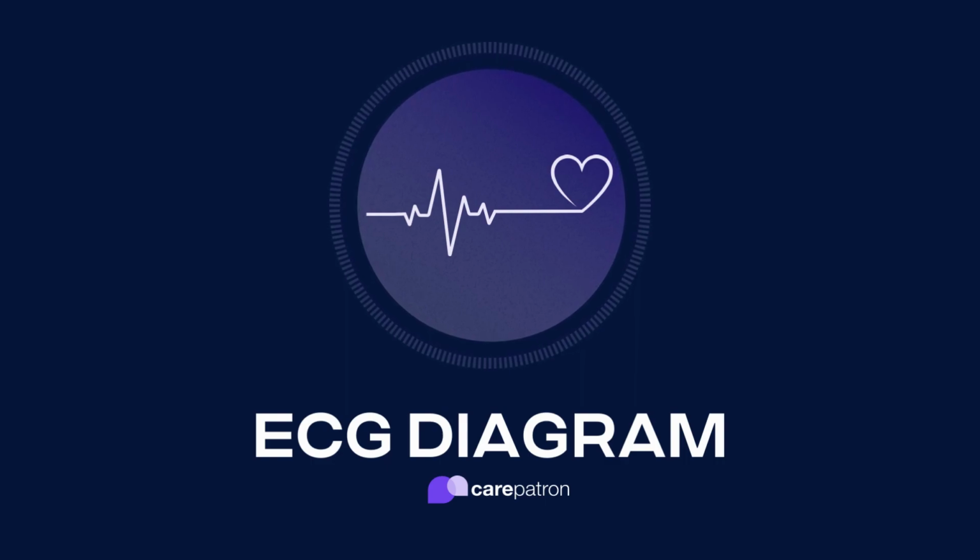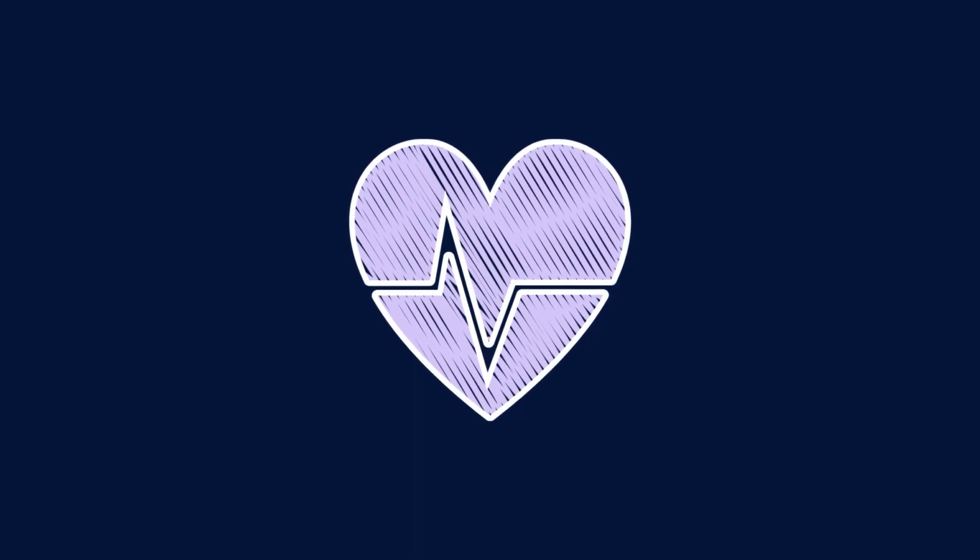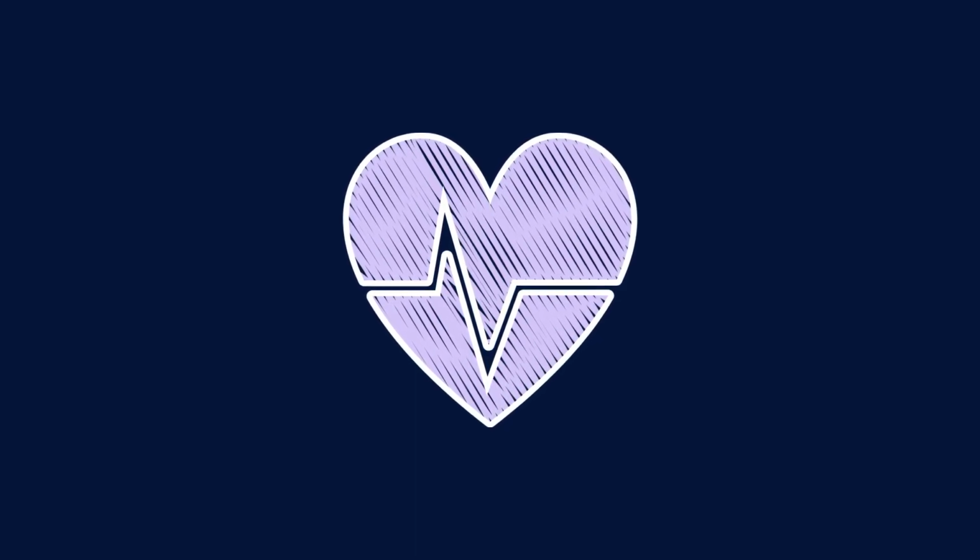An ECG diagram is a visual representation that provides information on how well the heart is functioning and how often the patient's heart beats. One can see these pieces of information in the form of waves and waveforms.